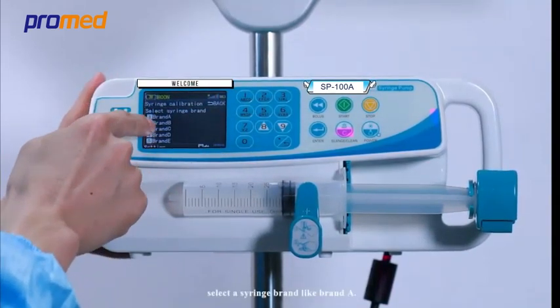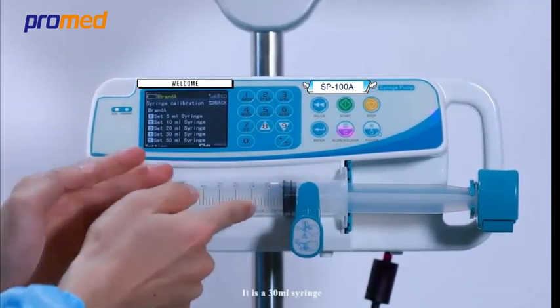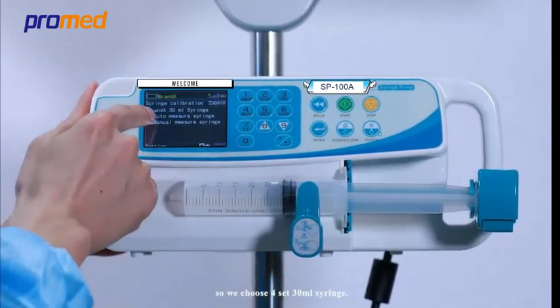Select a syringe brand, like brand A, then select a syringe size. It is a 30 milliliter syringe, so we choose option 4 to set the 30 milliliter syringe.